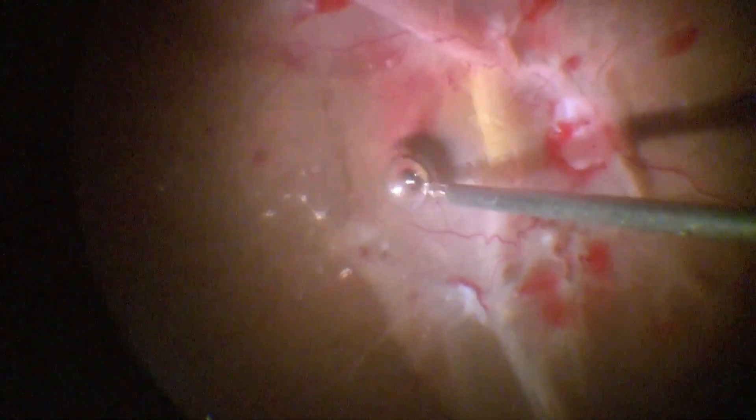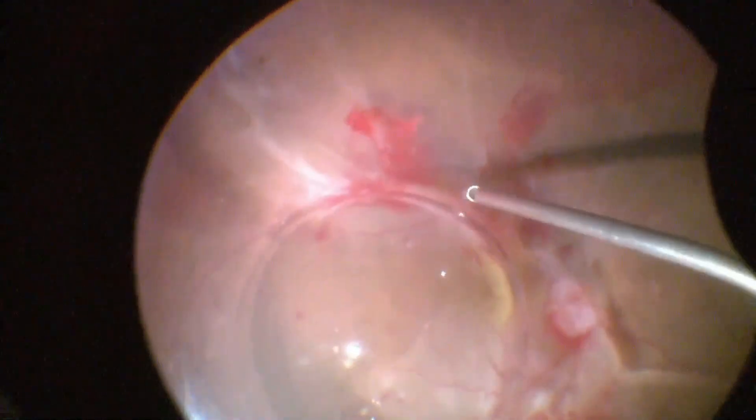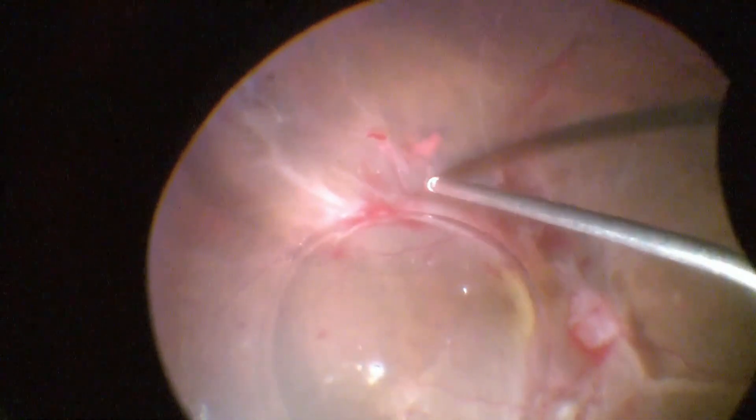PFCL was injected to help stabilize and flatten the posterior pole. Blood is aspirated and diathermy is used to stop active bleeders.